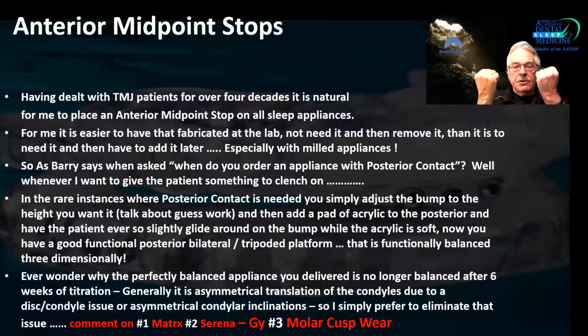So essentially, you've taken that bite registration closer to the therapeutic sleep position. So now all this condylar stuff has already played out in your bite registration, instead of fabricating an appliance at a position that you think is correct, and you've got all this condylar stuff and disc stuff and muscle stuff programmed into that fabricated position, but then when you titrate it, that becomes a different animal. Let me explain it this way.